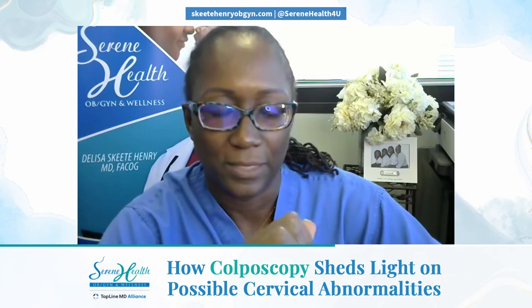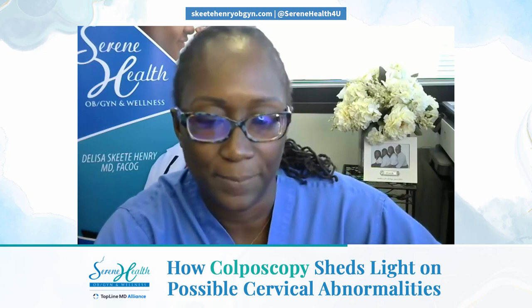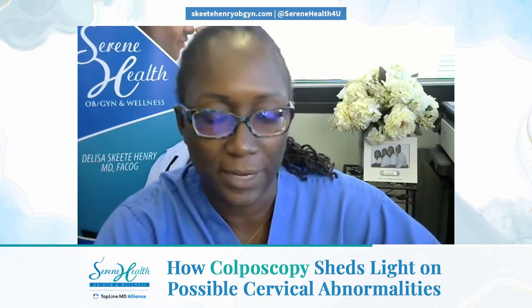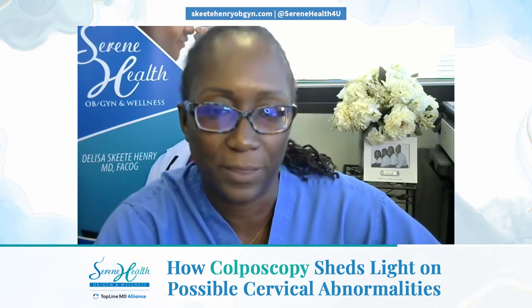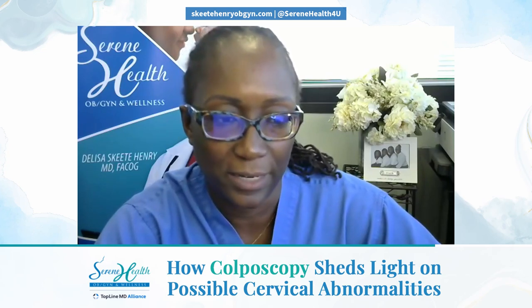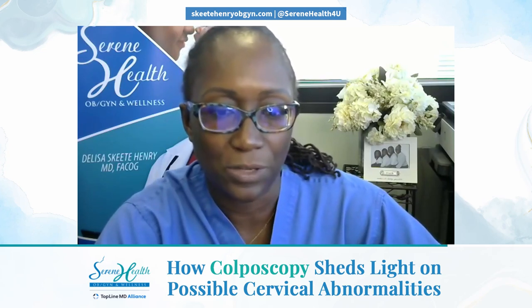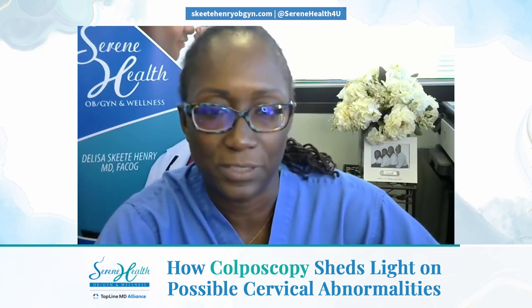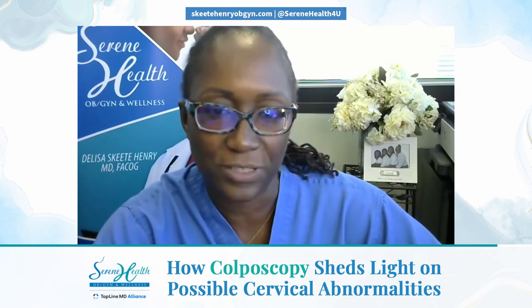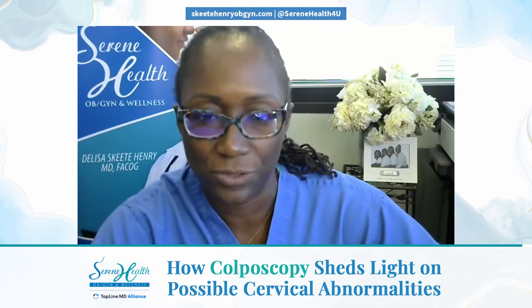We take a targeted biopsy if we see a suspicious area, and we're able to send that to the pathologist, and they're able to tell us if there is what we call cervical dysplasia. Cervical dysplasia is the precancerous changes to the cervix.